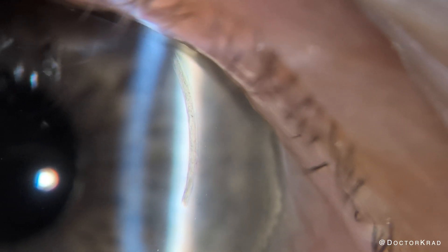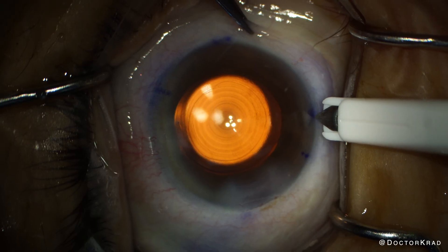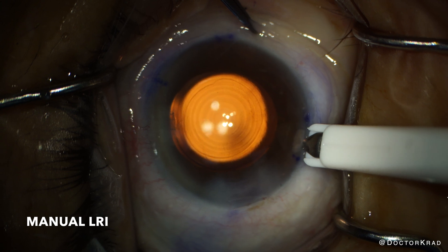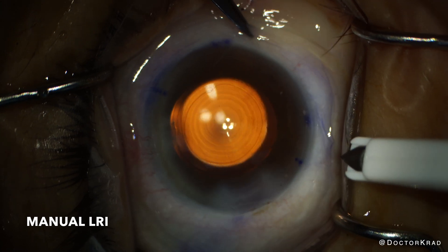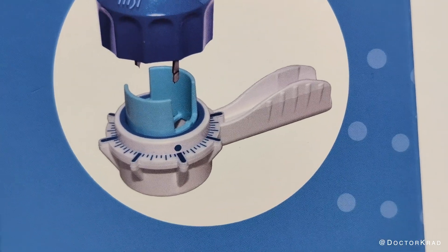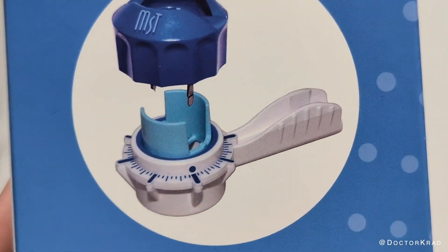Laser is prettier, precisely arcuate or curved, but also much more expensive. Manual LRIs work too, are much cheaper, but definitely not as pretty or precise. A new device by MST called the ARC Duo attempts to bridge that gap.